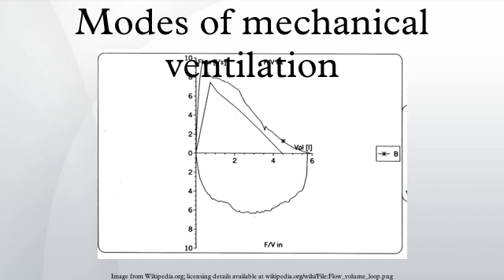IMV with pressure support is the most efficient and effective mode of mechanical ventilation. Intermittent mandatory ventilation has not always had the synchronized feature, so the division of modes was understood to be SIMV versus IMV. Since the American Association for Respiratory Care established a nomenclature of mechanical ventilation, the synchronized part of the title has been dropped and now there is only IMV.